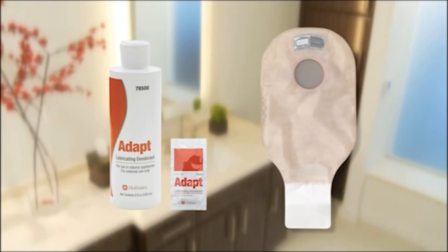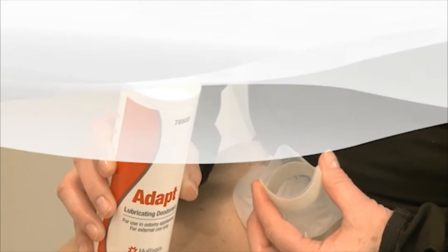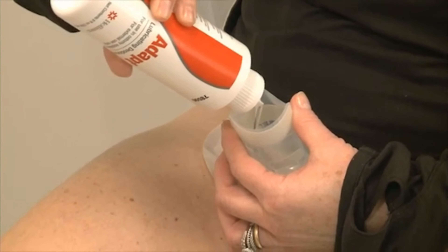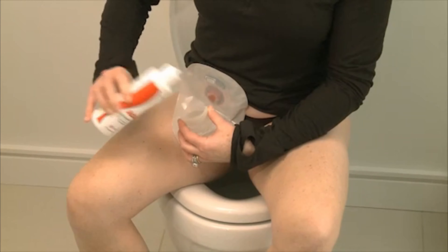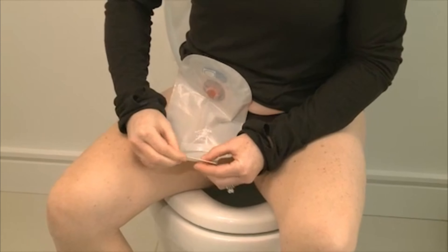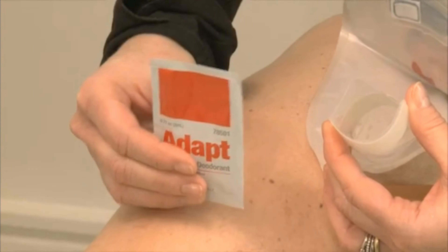To use Adapt Lubricating Deodorant, you will need to add about one teaspoonful to the inside of your ostomy pouch. Do not use less, or it will not be as effective.